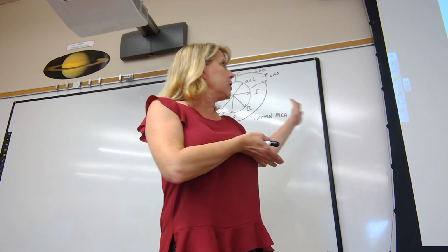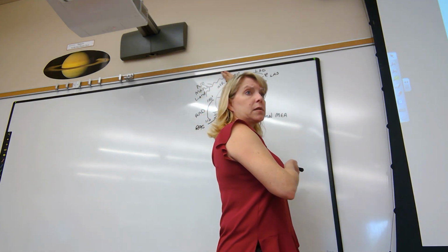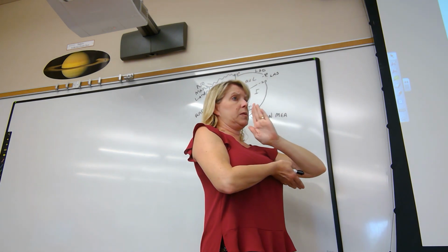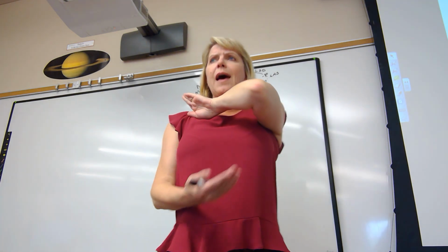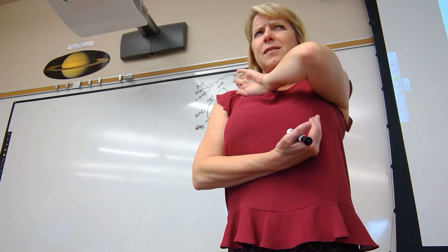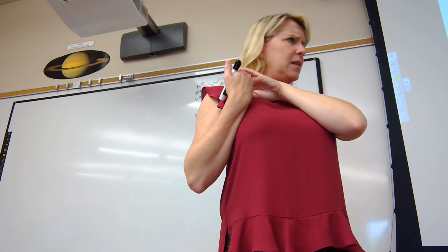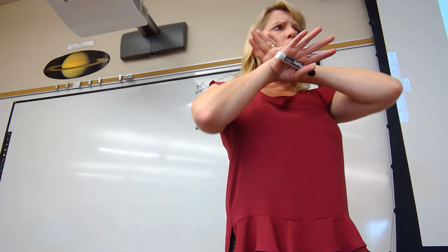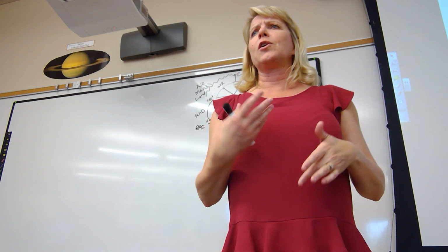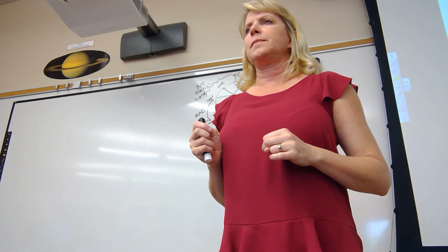If you have current going up and to the right, that means electrical current is starting in the apex and going up to the atria. You know that no person's electrical current should be going up and to the right. That's why we call it no man's land.